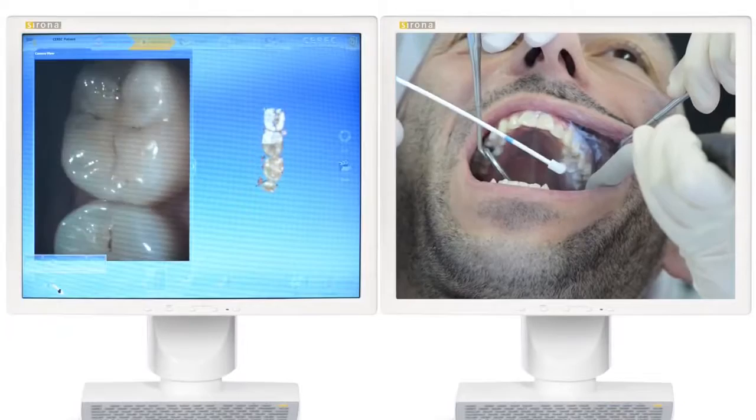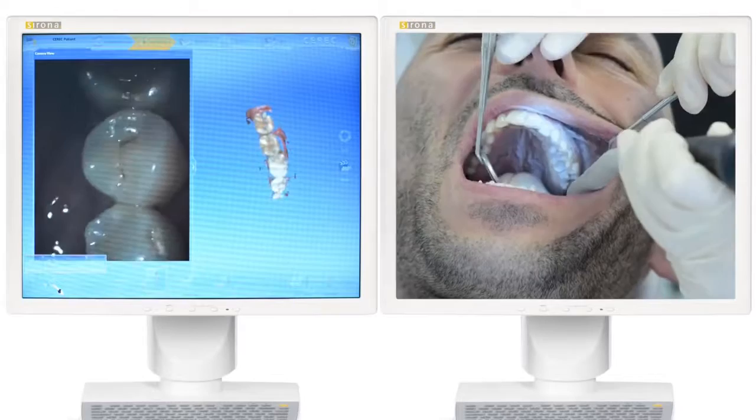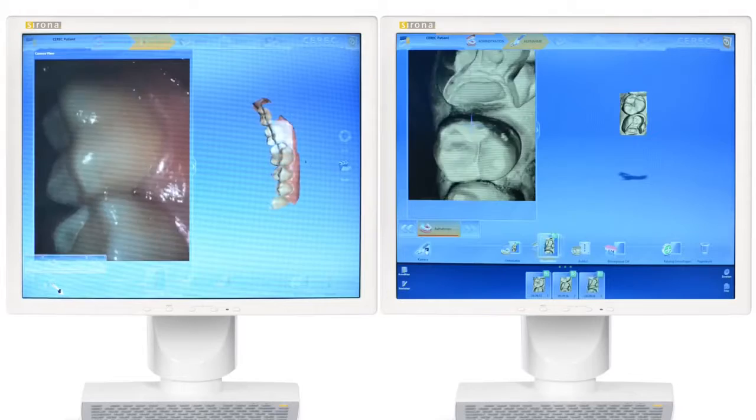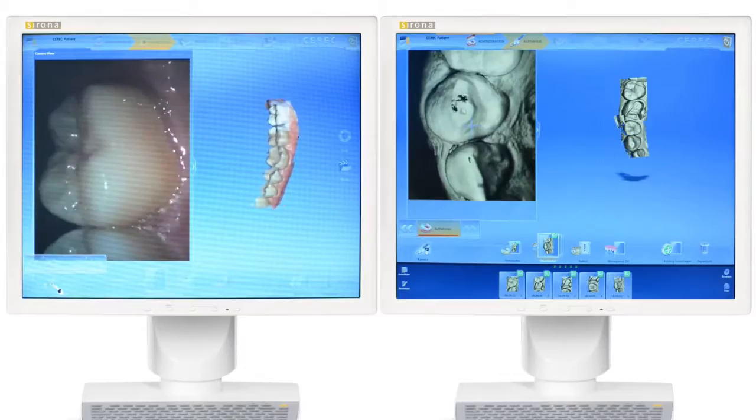In direct comparison, the BlueCam is convincing with its speed in single tooth restorations despite requiring powder. Omnicam, being powder-free, inspires with a continuous flowing scan process and 3D images in natural color.